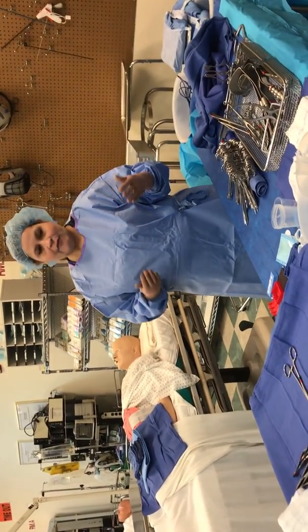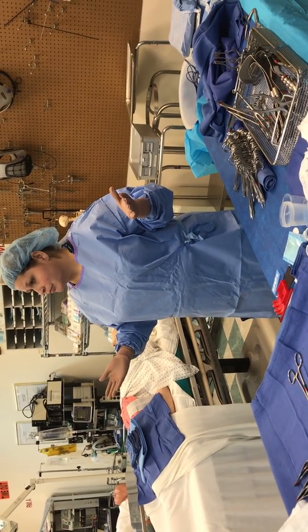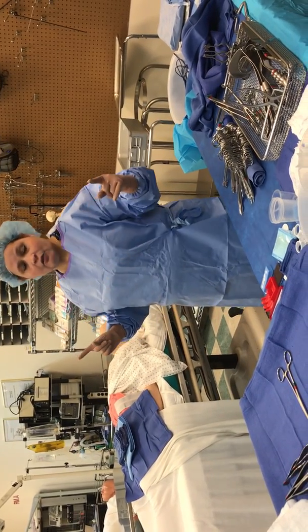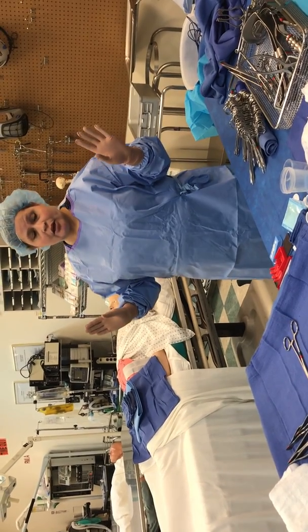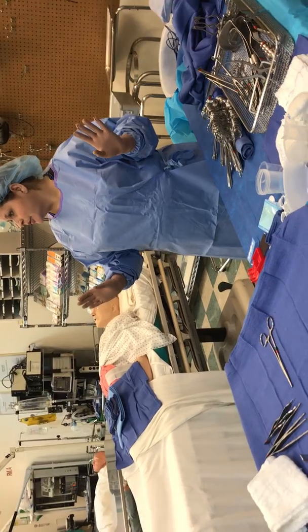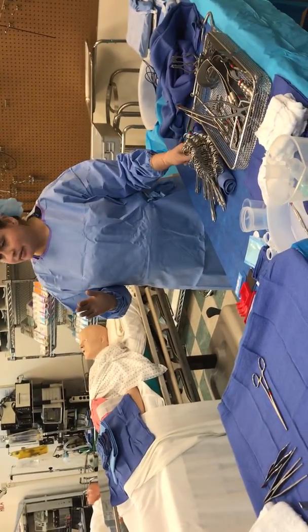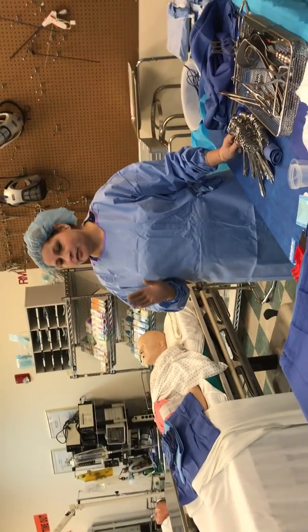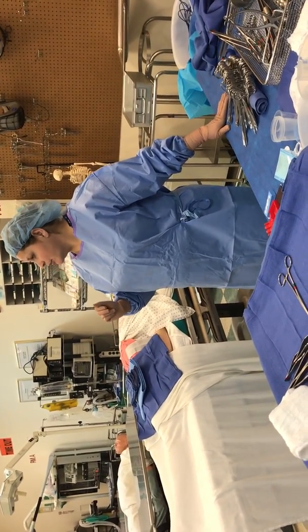Okay? I've worked with a surgeon who all he uses is a right angle. Huge open cases, just a right angle. All I need is a long right angle and a short right angle. As long as I have those two and hemostats, I'm good. Always have the Mayo and the Metz. And that's it. And I keep my Kellys too. But for most of the surgery, he uses the right angle.